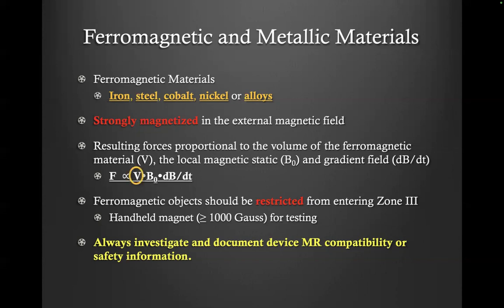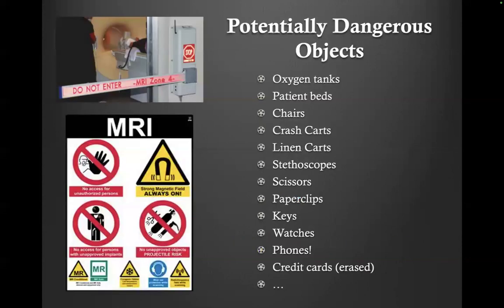I just want to emphasize this volume. For potentially dangerous objects, I'll just throw out a list here: oxygen tanks, patient beds, chairs, gurneys, linen carts, scissors, paper clips, keys, watches, phones, credit cards. Credit cards won't fly. They are plastic, but they are going to be erased, if you don't want to go get a new card.